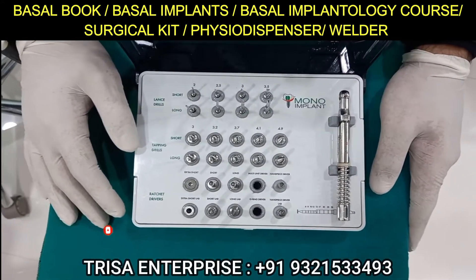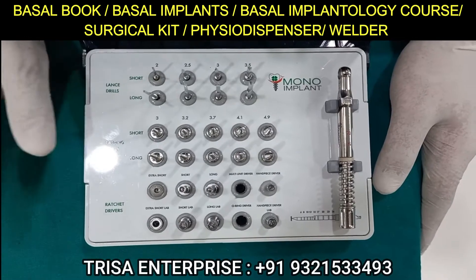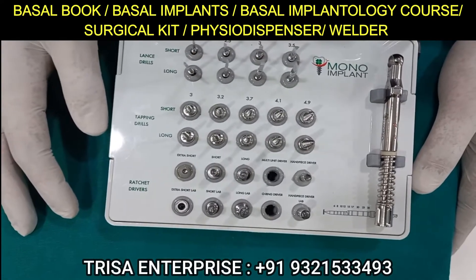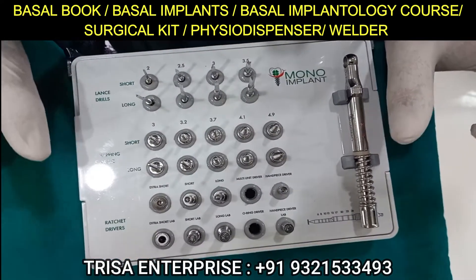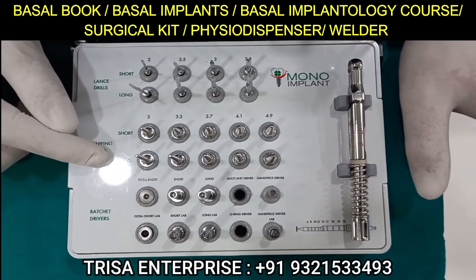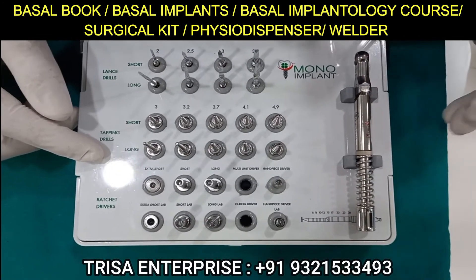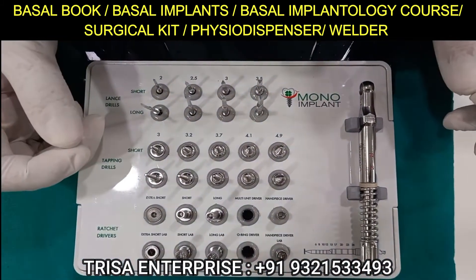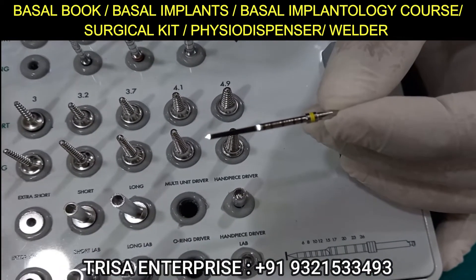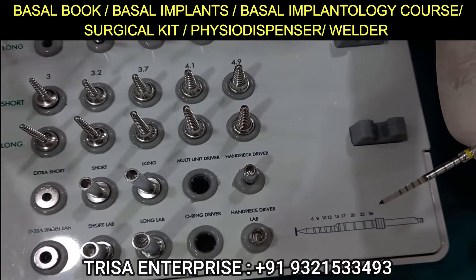If you want to go beyond 30mm for a zygoma or similar case, the drills are different and the level of expertise required is different. If you have preoperatively planned — say 14mm, maybe 17mm — and you are going to 20mm, you should start questioning why. You can also take a quick chairside x-ray to counter-check; if there is something below the dent, you know at least 6-8mm, so 12 or 14 will be enough.